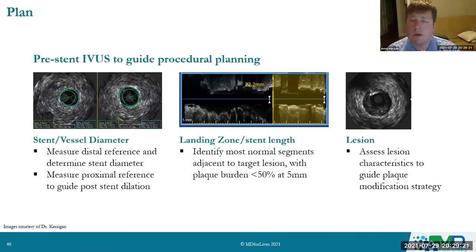So as we talked about, another case, and we'll go through some real life cases, some of the stuff that I've done in the last couple of months that I thought was a good example of this. We put the catheter down and we measure.